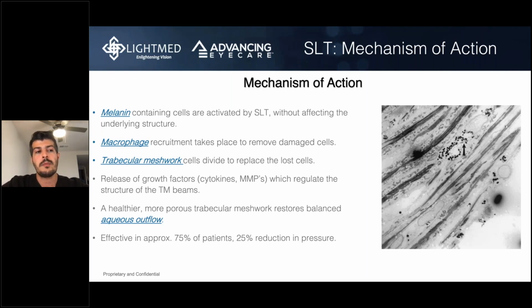The only exception is people with megalocornea. Their cornea is so steep and so large that you do not get total internal reflection. You are able to see the angle structures without a gonio lens. I would still not advise doing it without a gonio lens. So for all intents and purposes, the answer is definitely no.